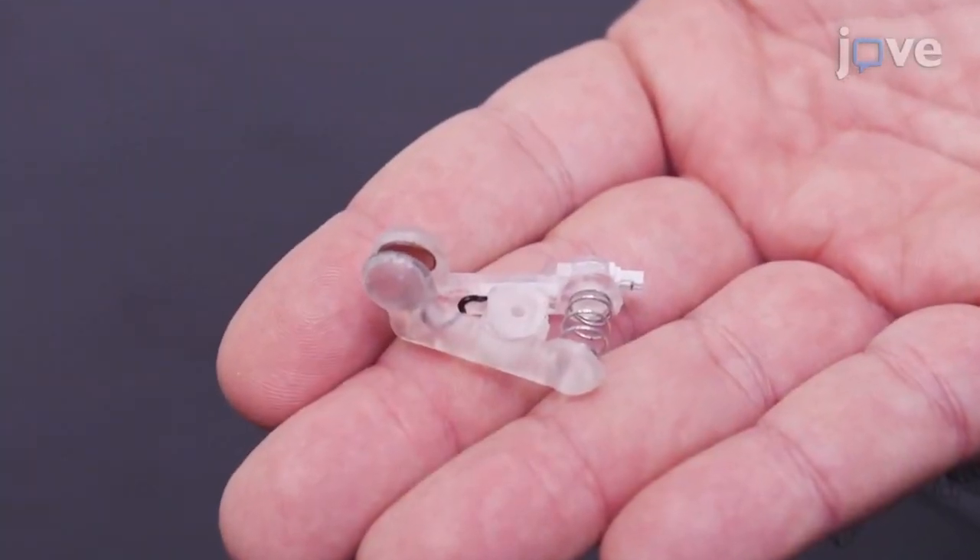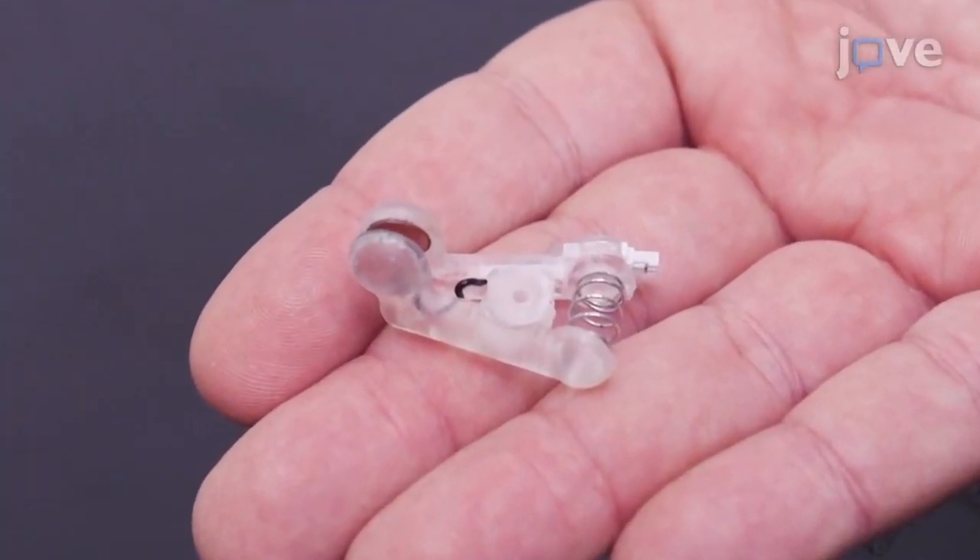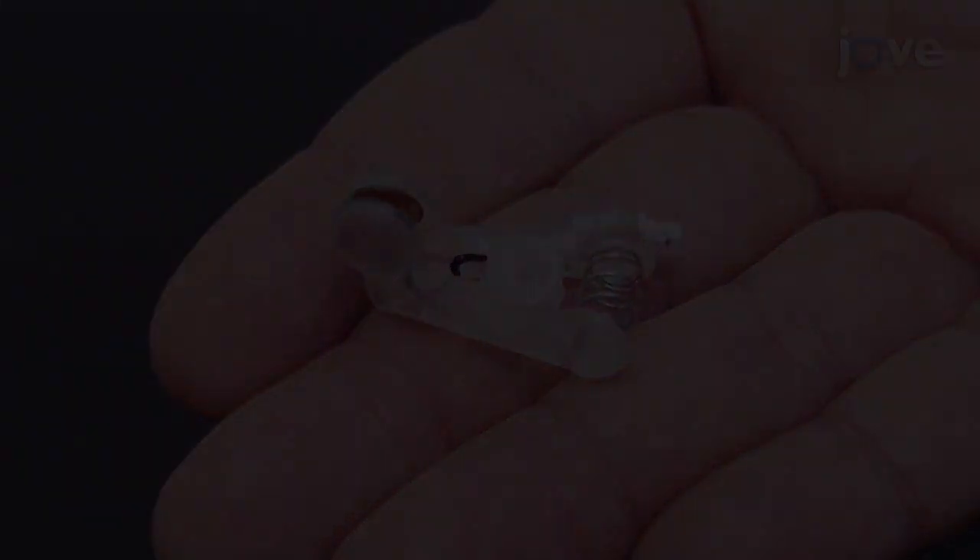Before placing the electrodes, visually inspect the materials to confirm that a clean, corrosion-free surface is present.